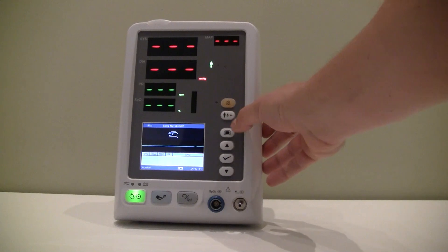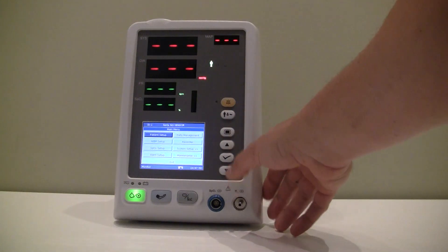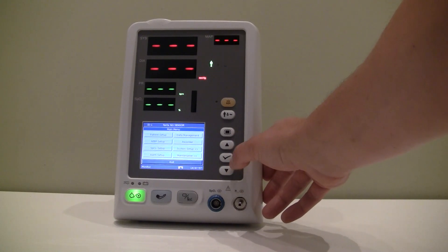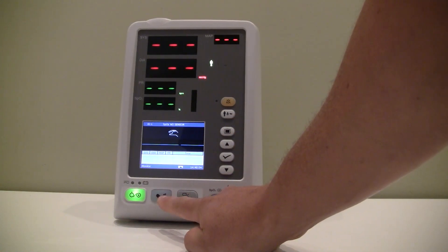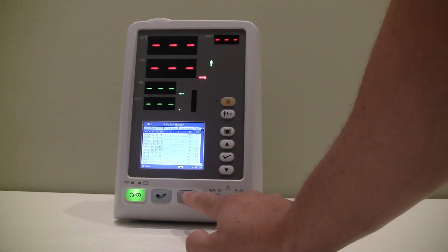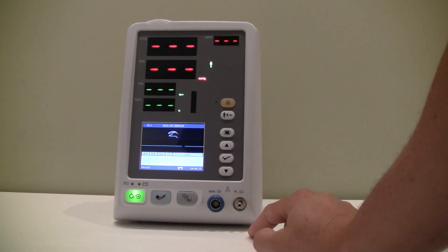There's an alarm key and a shortcut button to switch your patient type. The main menu button with up and down arrows and a check button in the middle allows you to select options on the menu screen. There's a power button, a manual NIBP reading button, and a button to switch to trend data in table or graphical format. Here are the SPO2 connector and NIBP cuff connector.